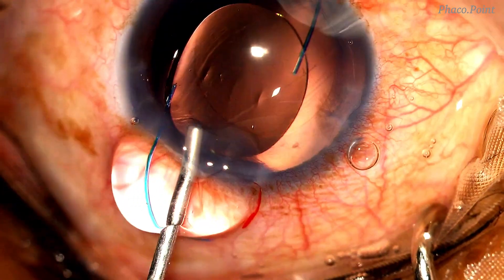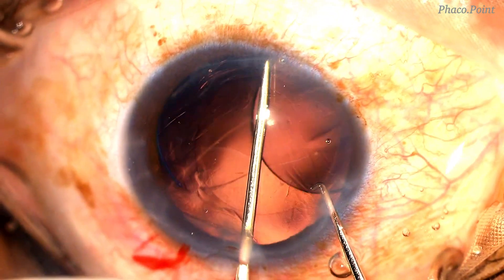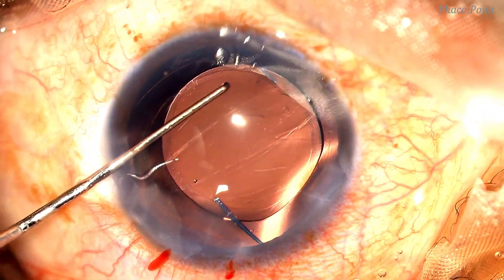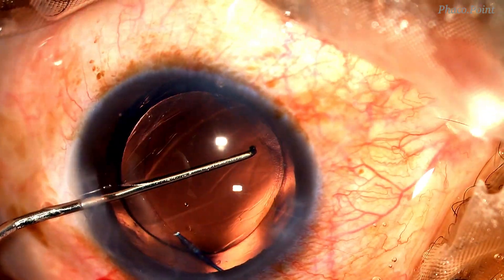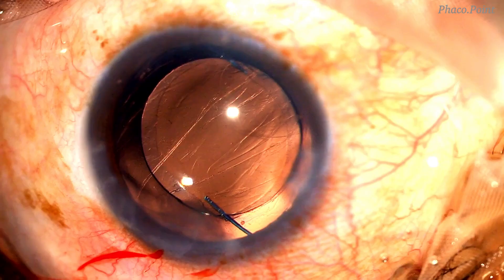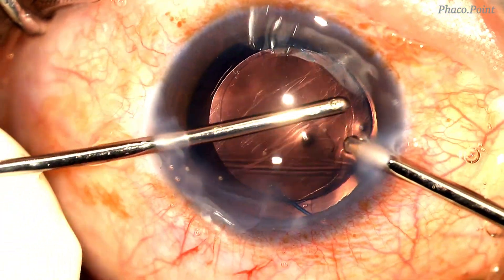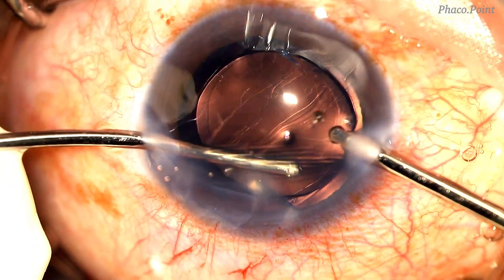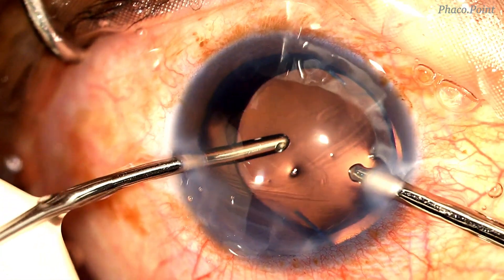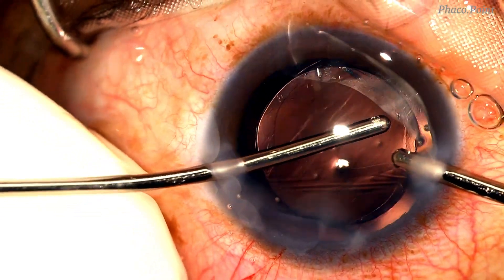Viscoelastic is further introduced into the anterior chamber to deepen it, and then with the help of a Kuglen hook, the trailing haptic is dialed into the ciliary sulcus. We now perform a posterior optic capture wherein the optic is pushed behind the rhexis edge on either side. You can clearly see the ovalization of the rhexis from the successful posterior optic capture. With extreme care and caution, the excess viscoelastic is gently removed — one should be extremely cautious as the irrigation flow can cause deepening of the anterior chamber and loss of posterior optic capture.